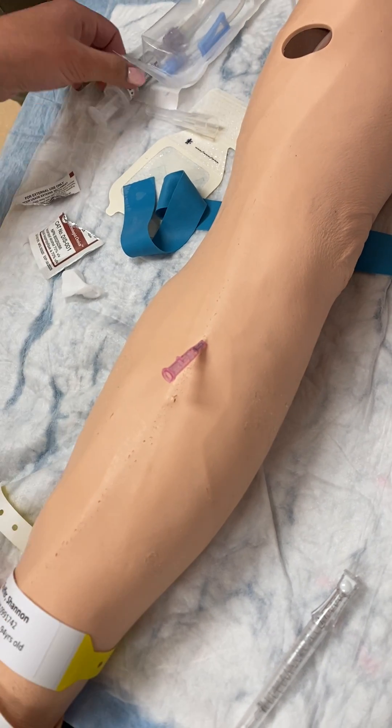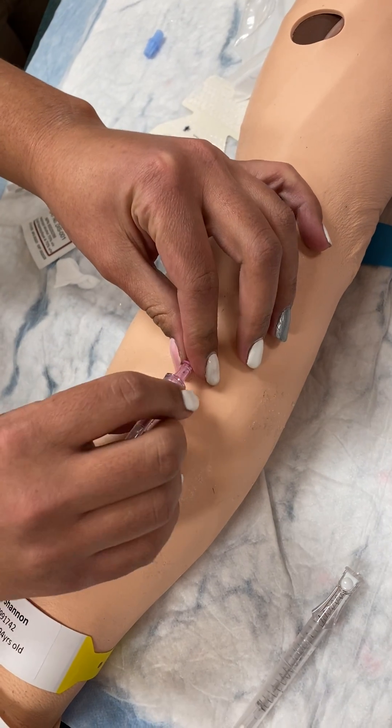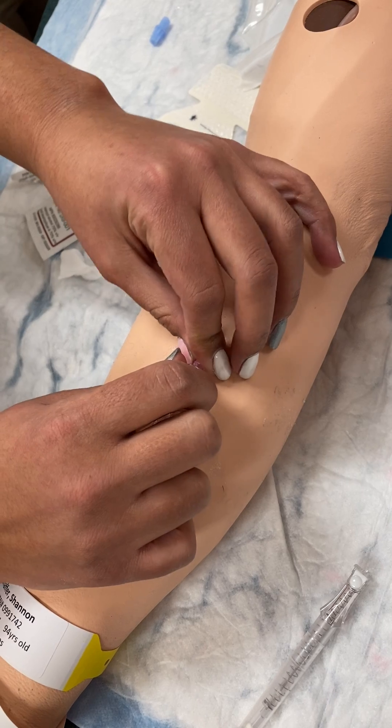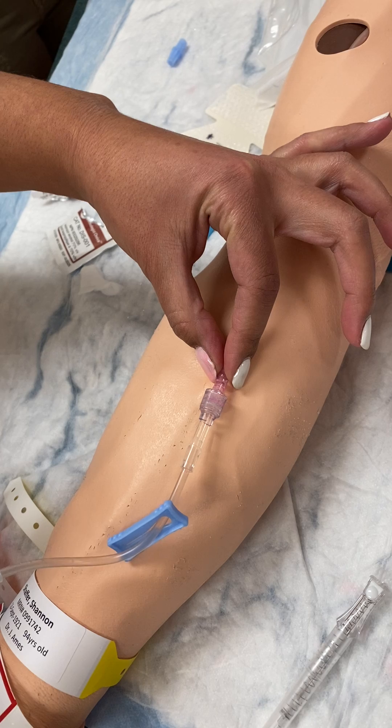Release the tourniquet and attach the normal saline lock. She's going to flush — make sure it flushes well.